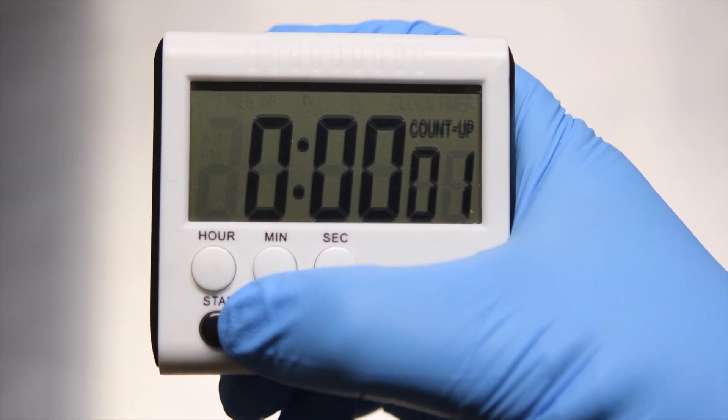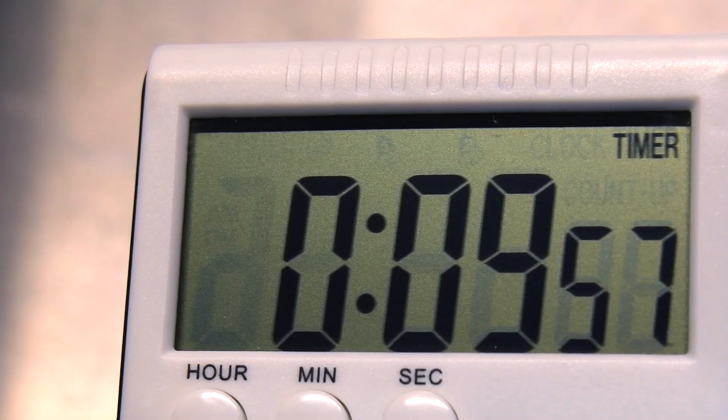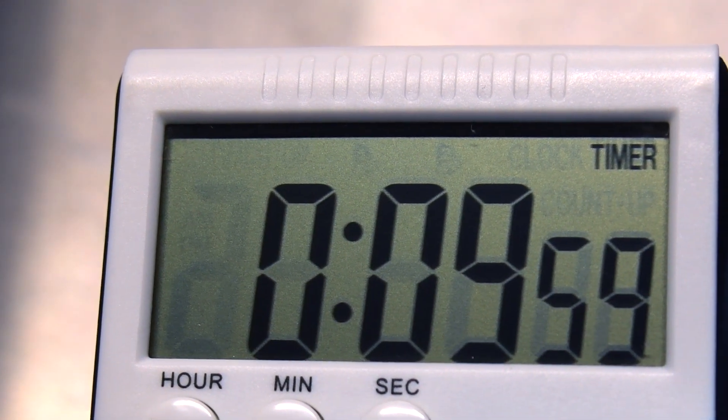Start a chronometer or timer while opening the gas valve. The sample is complete when the programmed number of minutes has been reached.